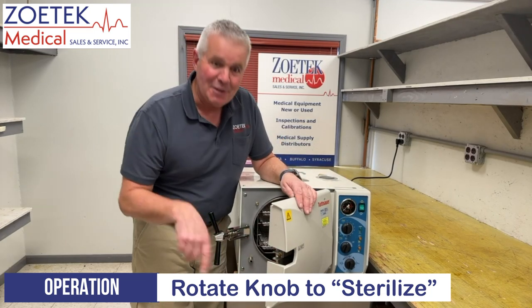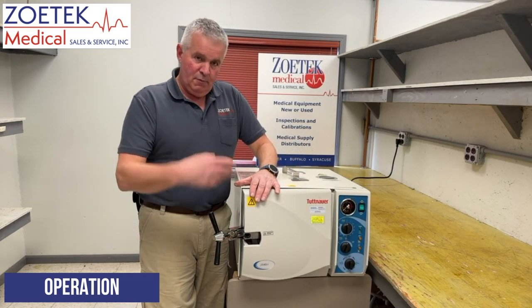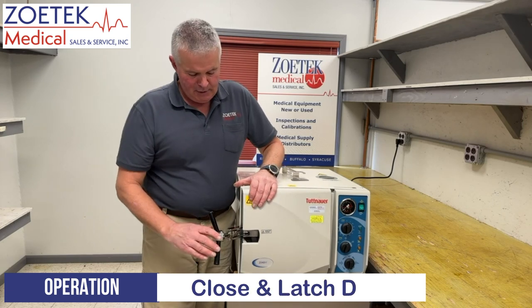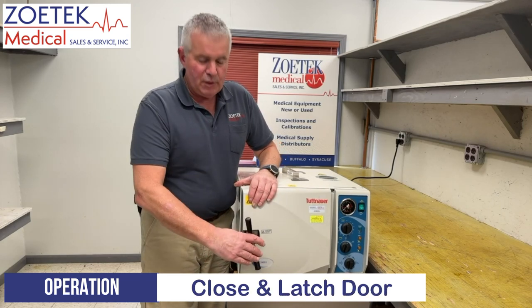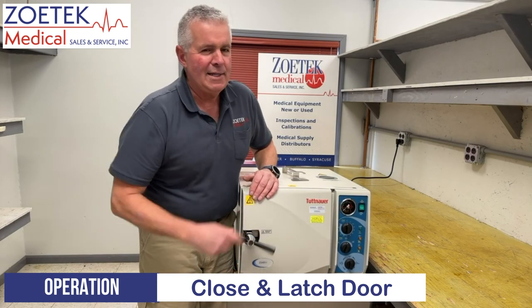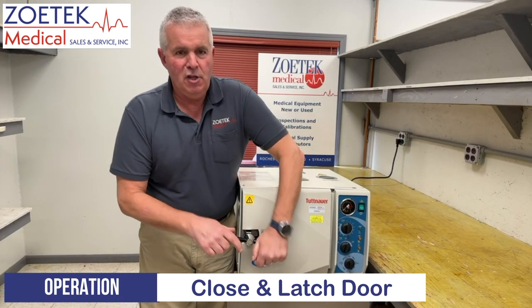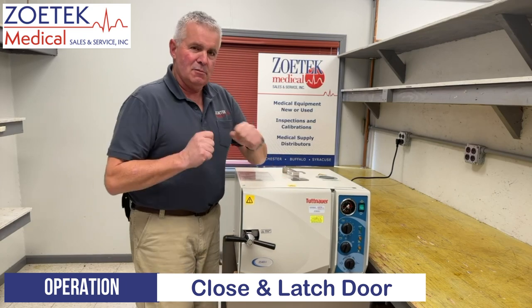When we're in the sterilize position, we've already loaded whatever we want to sterilize. We close the door, rotate our handle back into the forward position, and then we want to just snug this — we don't want to crank it down super hard. If it's got a good door gasket on it, just a snug turn is all you need.